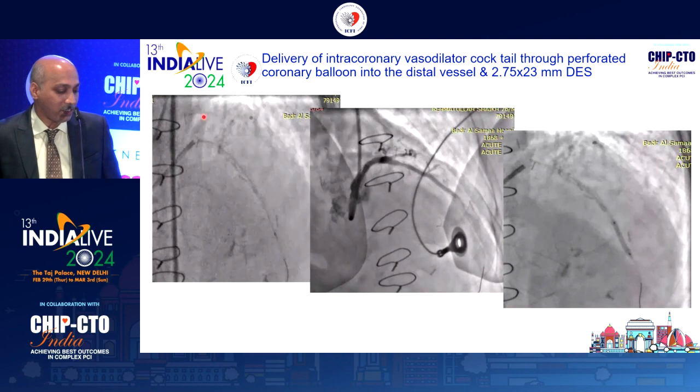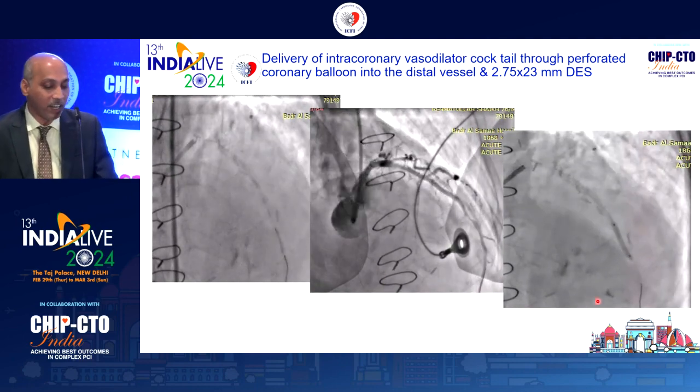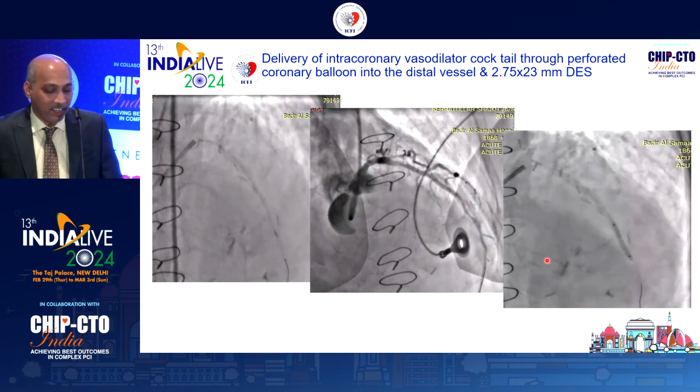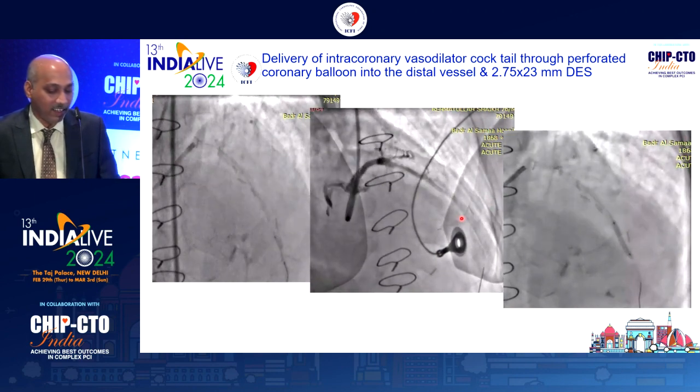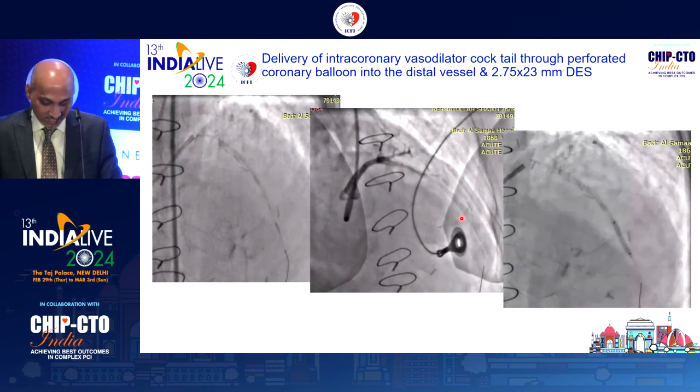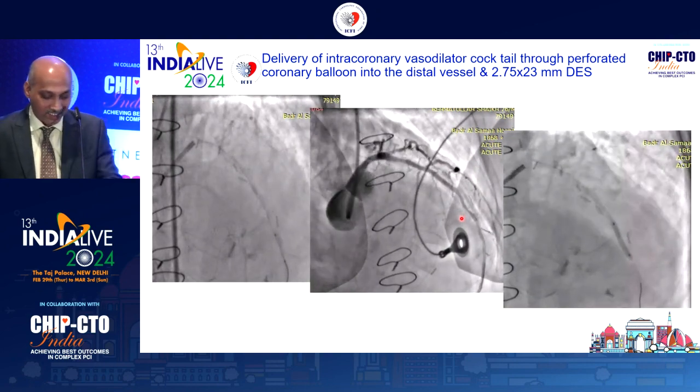The first angio shows the distal most LAD. After that, flow was established. You can see in the second angio, flow got established. You see the middle vessel. So now, in such a patient, you can put an IABP. Yes, we did everything. Okay, good. Thank you very much.